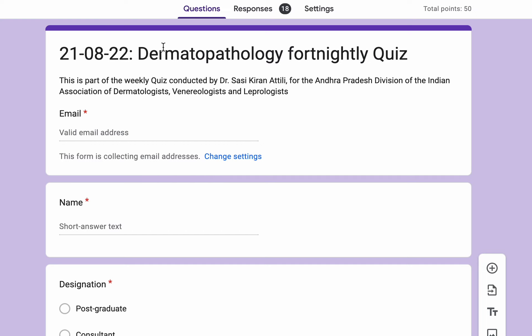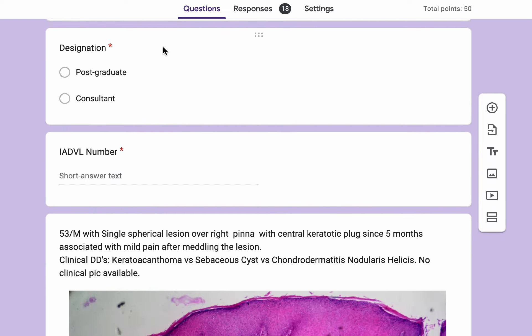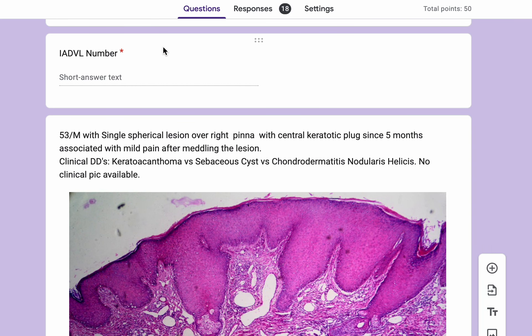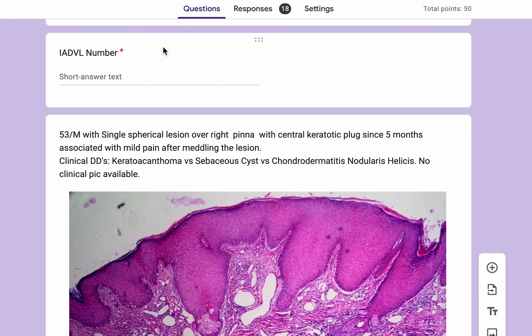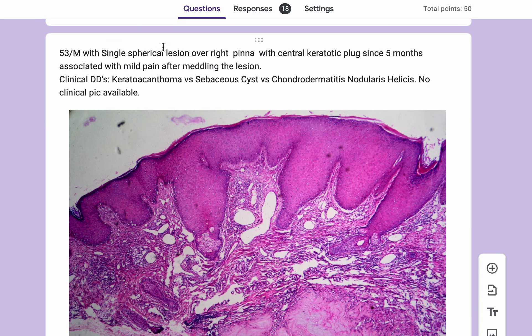Hello everybody. Here's the answer to today's quiz. This is a 53-year-old male with a single spherical lesion over the right pinna with a central keratotic plug since five months. The clinical differential diagnoses given were keratoacanthoma, sebaceous cysts, or chondrodermatitis nodularis.